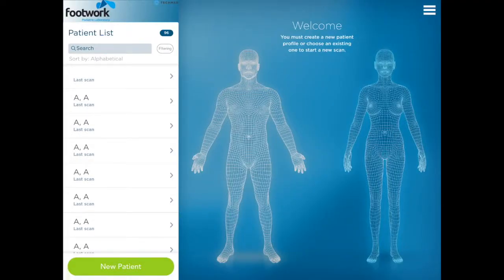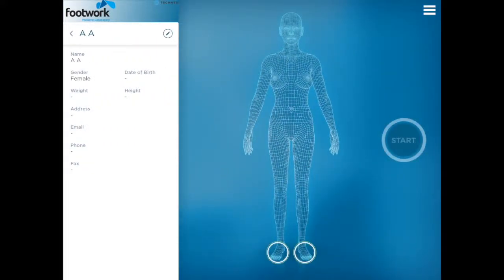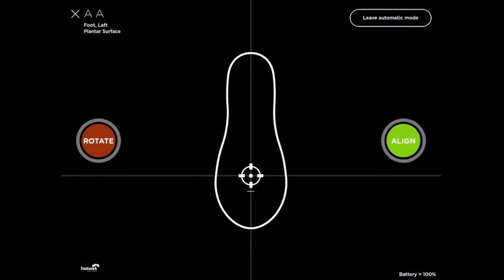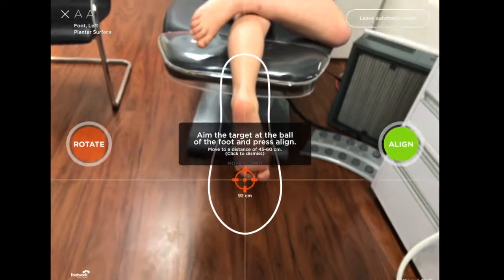Hi guys, George Merley here at Footwork with another nifty update for those using the 3D Structure Sensor scanner on the iPad. This update is really useful if you're having trouble with the bounding box or scanning frame with really small or really large feet, and if you're wanting more control when framing the foot.